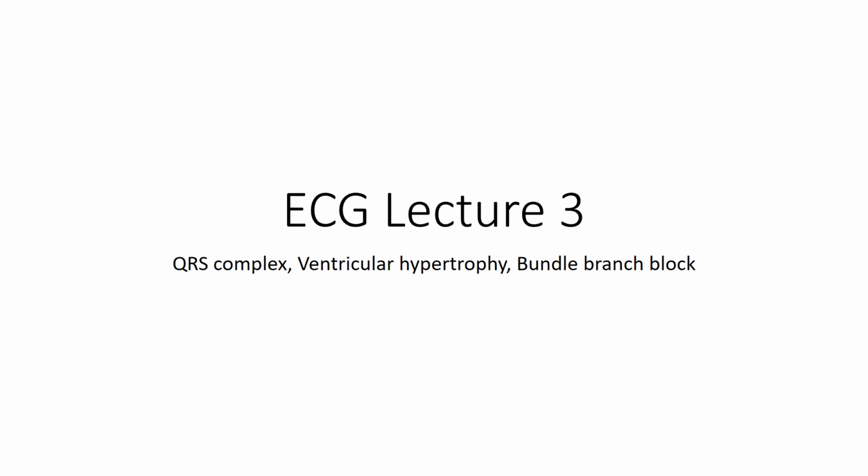This is Shehzad Ahmed presenting the third video in the series of ECG lectures. In this video, we will discuss the formation of normal QRS complex as well as the right and left ventricular hypertrophy and the right and left bundle branch block.